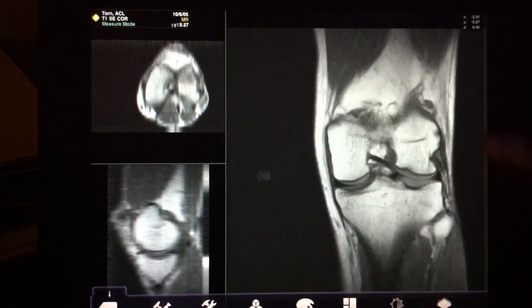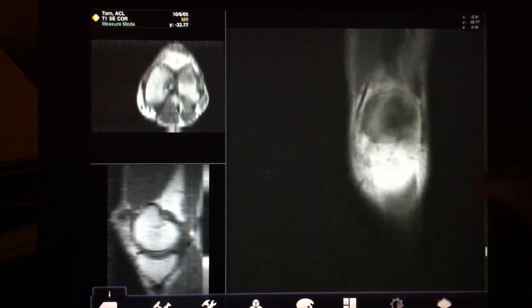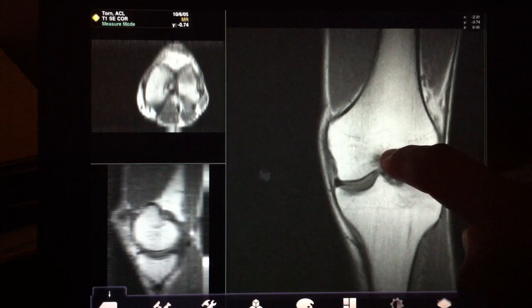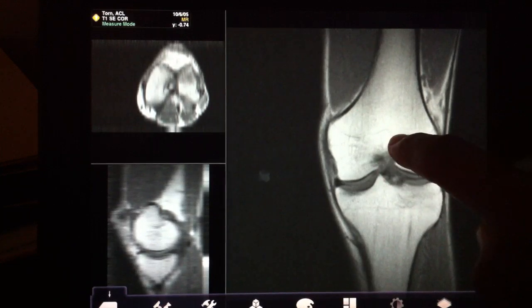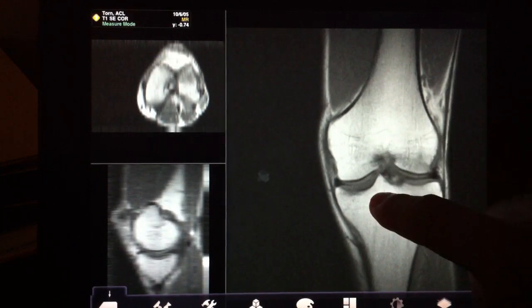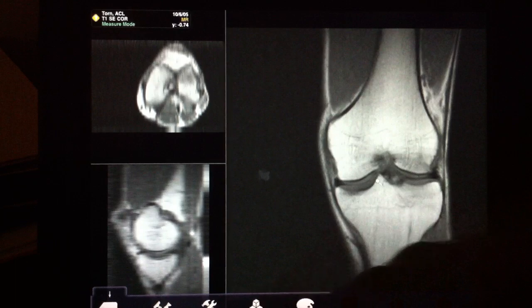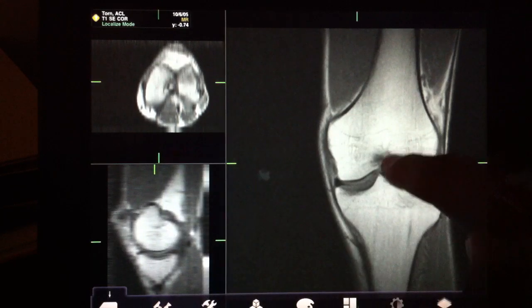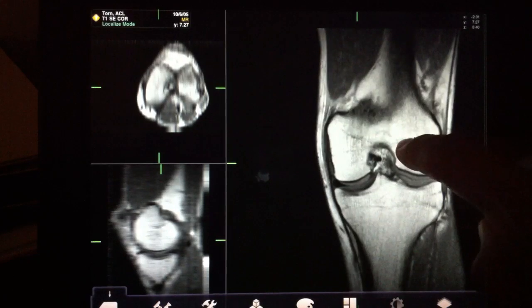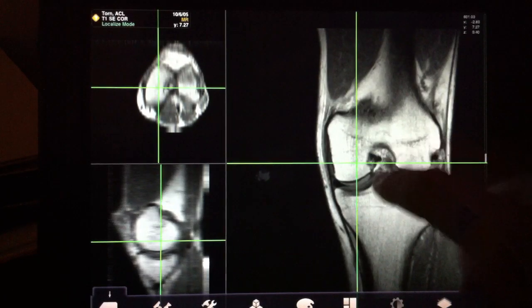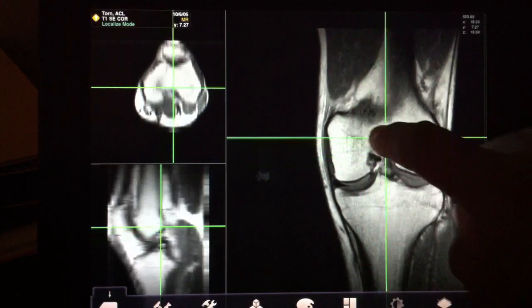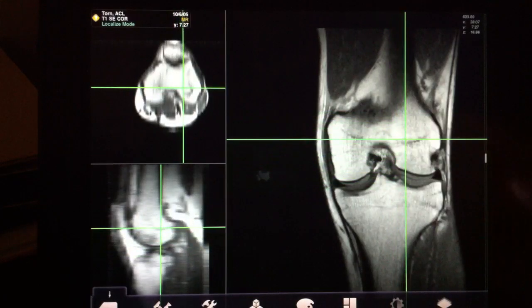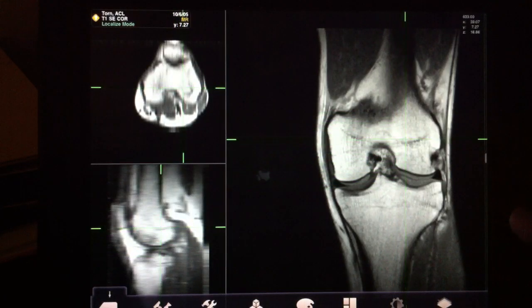As I navigate through one plane, initially nothing happens on the others, but by switching to localization mode — simply by tapping and holding — you can have all three screens going at the same time, which is pretty remarkable for a small device like this.